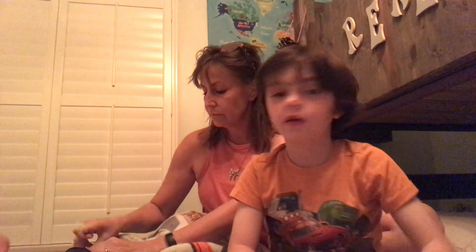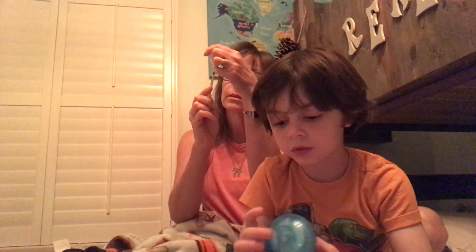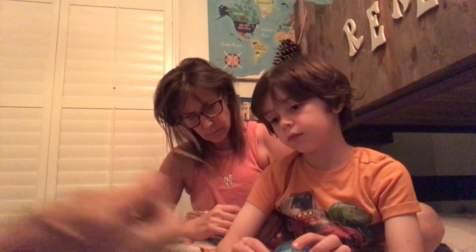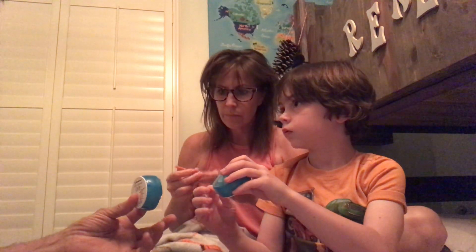Rexley's going to put an iPort on me first, and Daddy. So we've got two iPorts — one for Daddy and one for Mommy. While you prepare mine, I'll give you a little insulin. We're also doing a post-dinner correction in the dark because we don't have a sensor right now. That's okay — I know how to do it. And we're going to do some long-lasting.